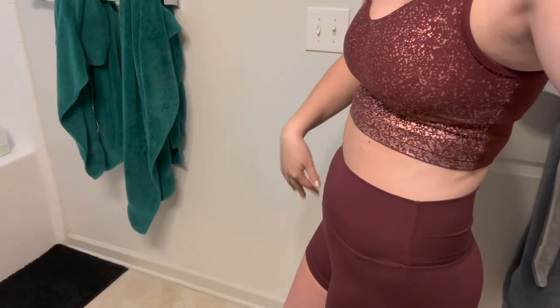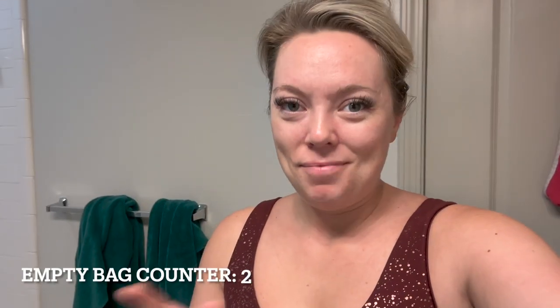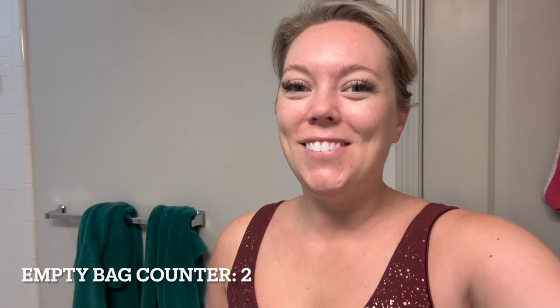Okay, 6:10, we're about to empty our bag before working out because like I told you before, we want this to be as flat as possible if you're gonna be doing any sort of on your belly type work, because I think of it like this. If I'm gonna be putting pressure on the bag and there's any sort of air or liquid in there, I just feel like there's a chance it could pop. I don't know how true that is, but that's just my thought. All right, let's do this and then we'll get to the workout.